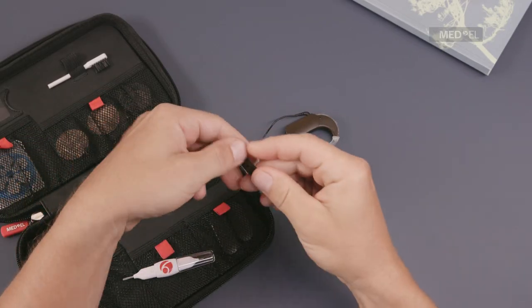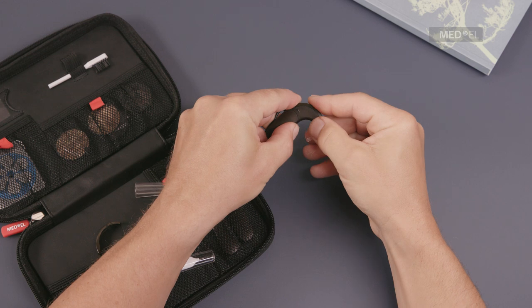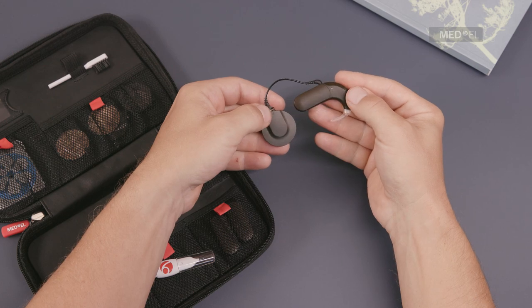Place the new cover over the control unit. Starting at the earhook end, press down until the cover snaps into place. The cover should be changed every three months, or sooner if you notice a change in sound quality.